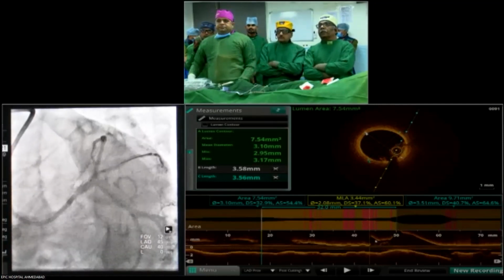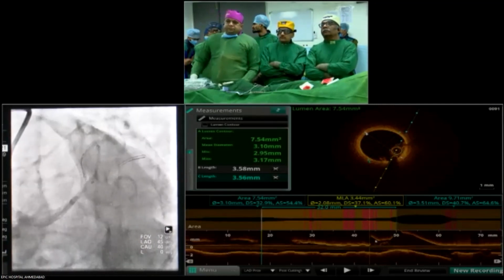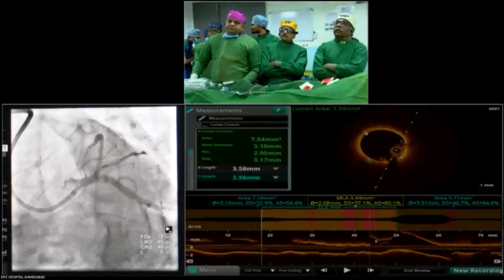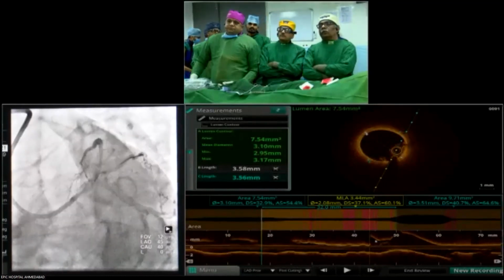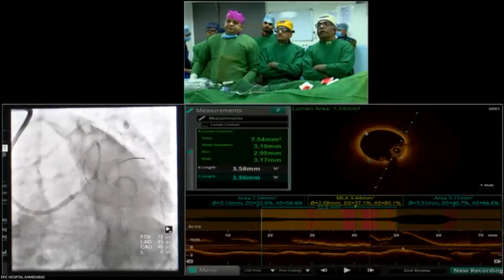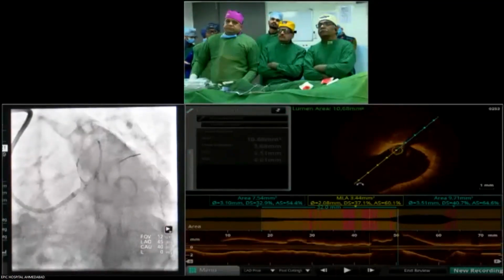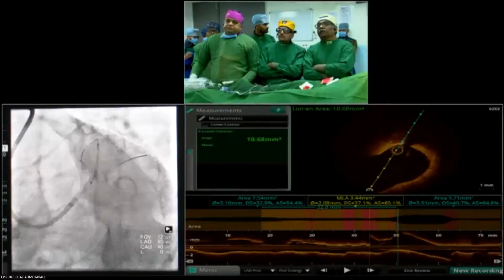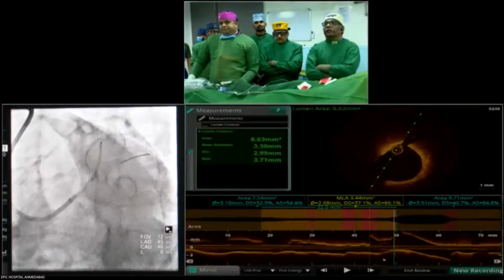Finished that? Okay, I was just about to ask you, how about putting a wire in the circumflex? I mean, you wanted to nail the ostium of the LAD. Yeah, the circumflex angle is so good. I can put the circumflex wire anytime. That's not an issue. Yeah, but you never know, it's a very big vessel. If stent struts come proximally in the left main, you will never know whether the wire will go in between the struts. Yeah, that's true. Let's see.